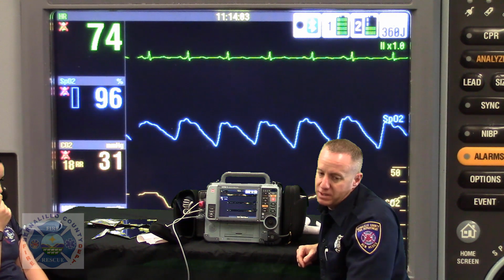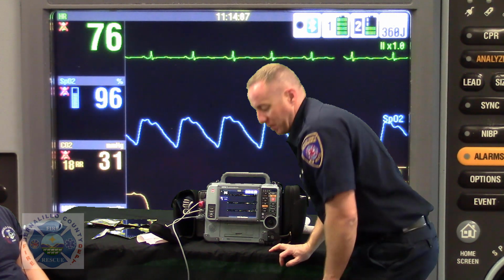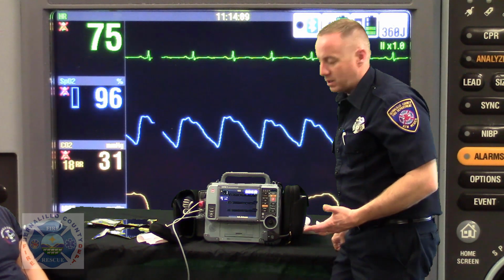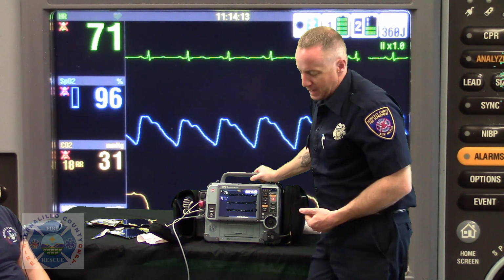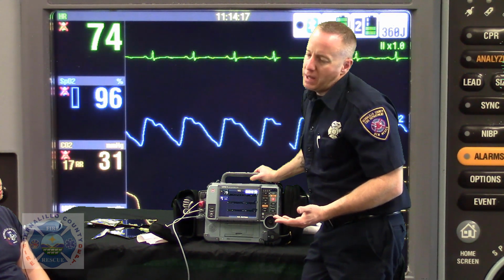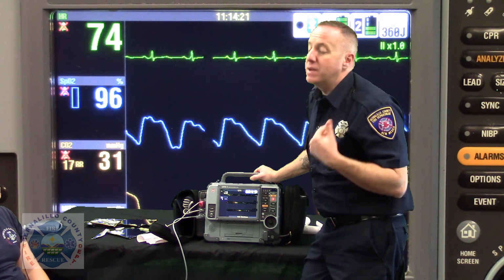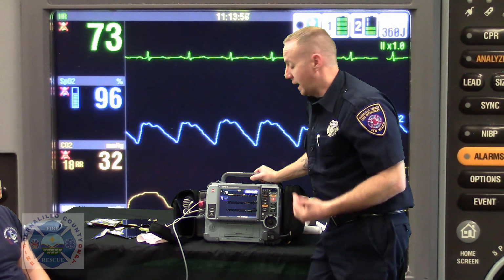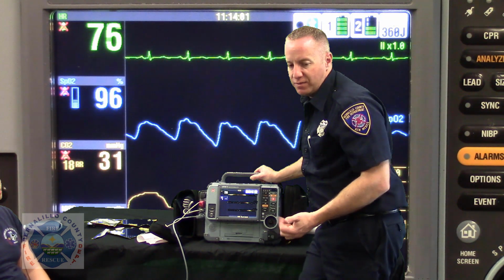Is the Cradlepoint working this morning when I checked my truck and my MDT? Am I within a close enough range to hit transmit successfully? And if you can't answer all that and troubleshoot it, then you're going to go back to your original plan, which would be to contact the ER you're transporting to and give them a verbal alert saying, I have a STEMI verified on EKG. We'd like you to go ahead and activate your cath lab.